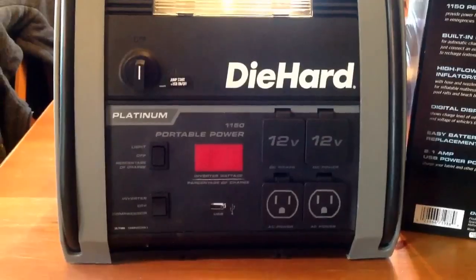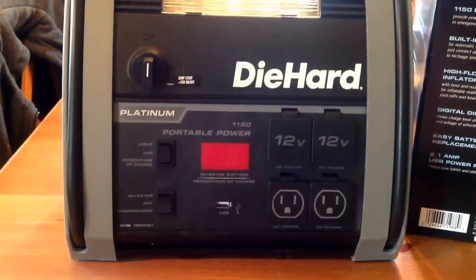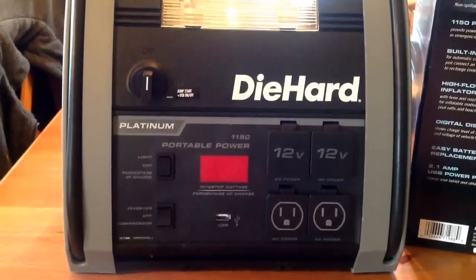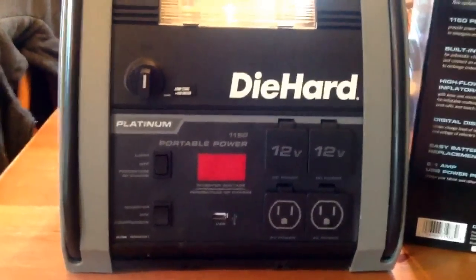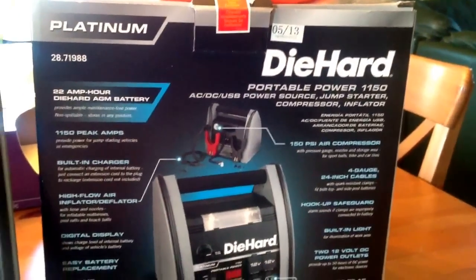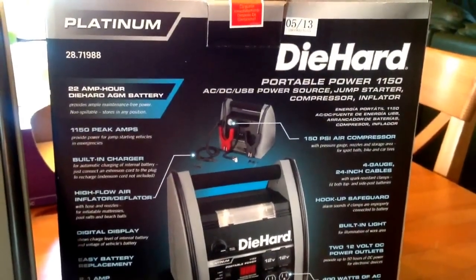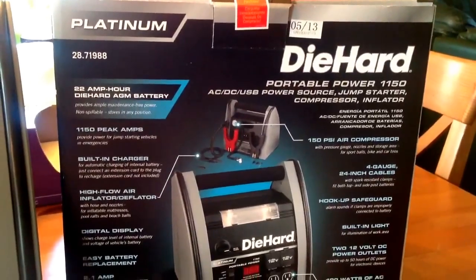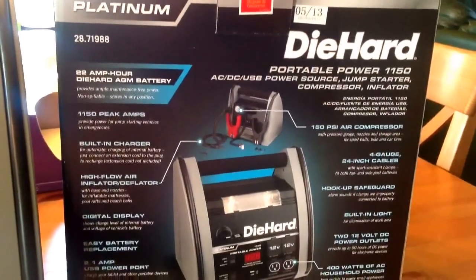All right, in a nutshell, what you need to know is the device needs to be charged 3 days out of the package before you use it. Pick yourself a good one and try to get one with the date that says, like this one says 513 on the top. Make sure that the seal is not broken, that someone didn't return it.